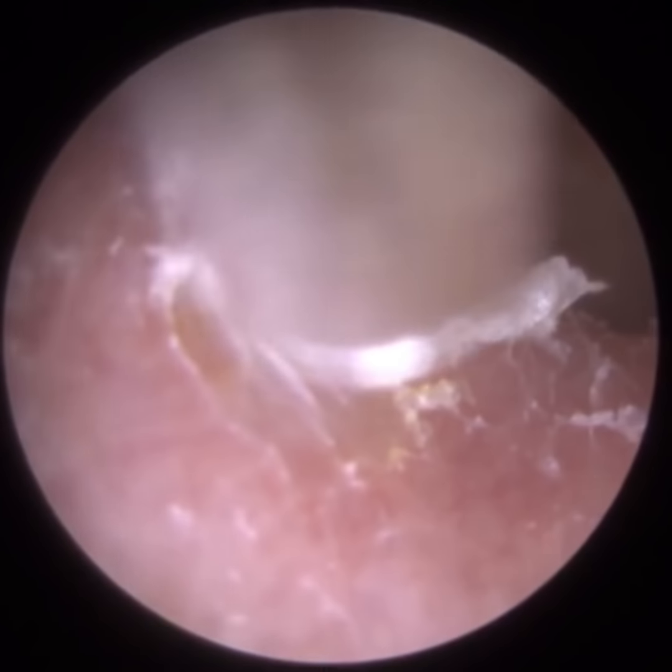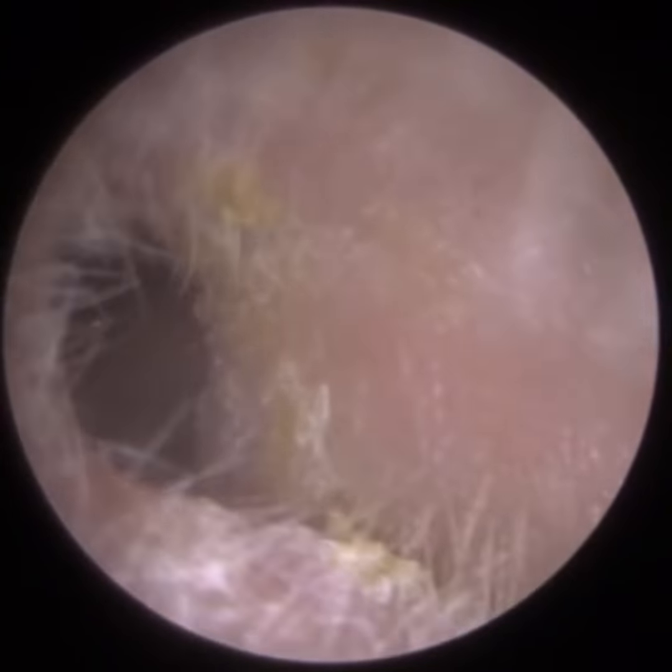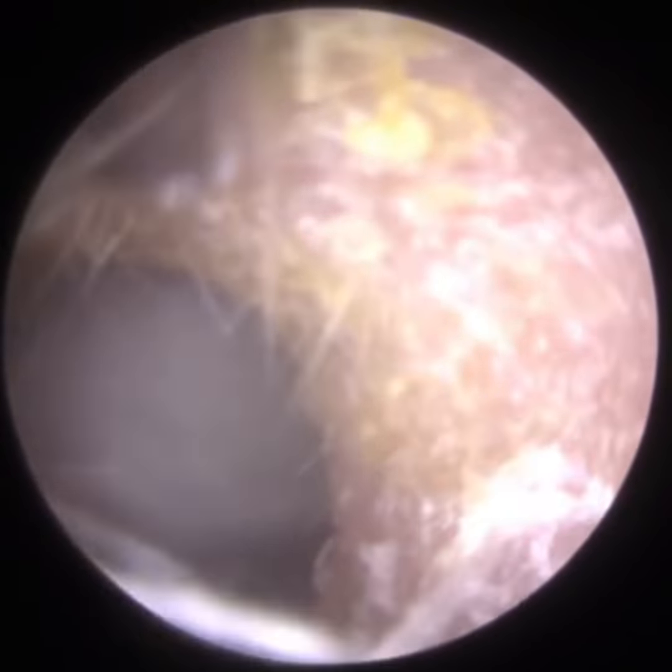So you can see we're nearly done here. I'm just trying to remove as much dead skin as I can. It's just a bit at the entrance. We know we're near the entrance. We can see all the hair strands there. You can see this dryness as otitis externa, eczema, if you like, of the ear. And there's a residual piece of skin on the eardrum that, because the patient's so used to the procedure, very, very still, I just decided to remove that for her.